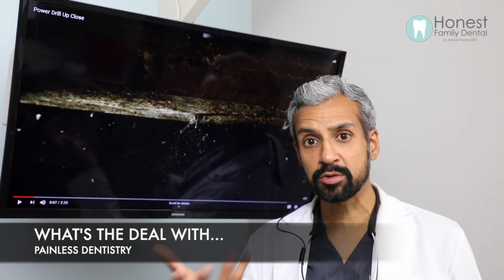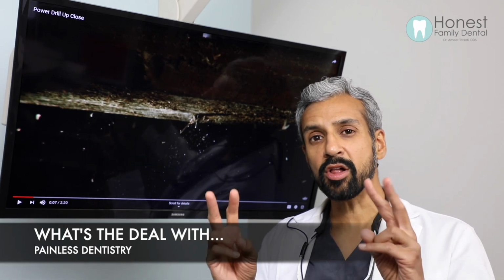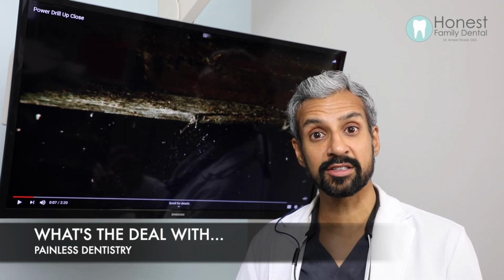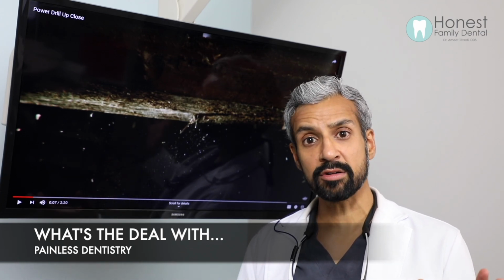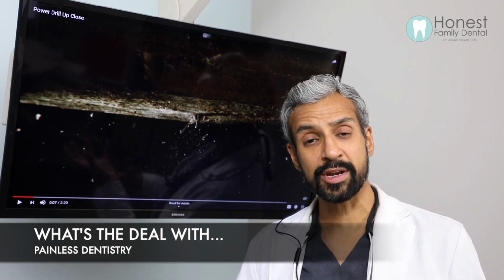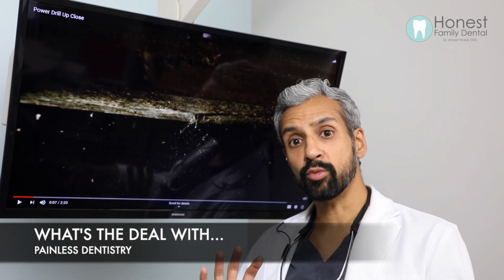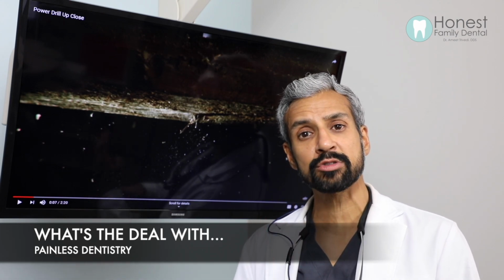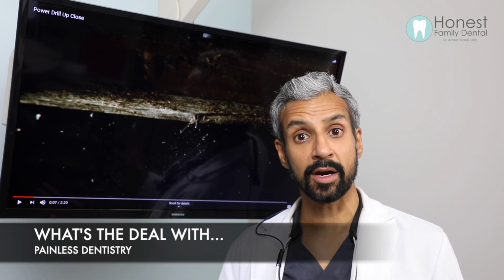So when you have that rotation moving through the tooth using a drill bit, we call it cutting the tooth, but if you look at it microscopically, it's not actually cutting the tooth, it's shattering the tooth. When something's being shattered, like enamel, that translates to pain. The drilling also creates vibration to the nerve. That translates to pain. The rotation also creates heat. That's why I use a lot of water, and that heat translates to pain. So there are three things that translate these different energies, and they come out as pain to the tooth, all right?